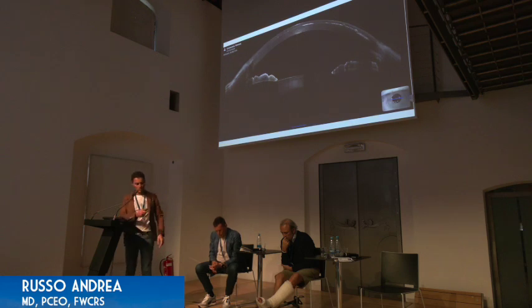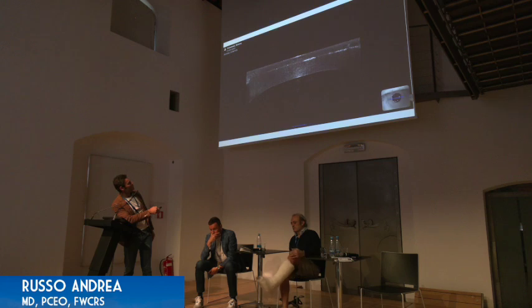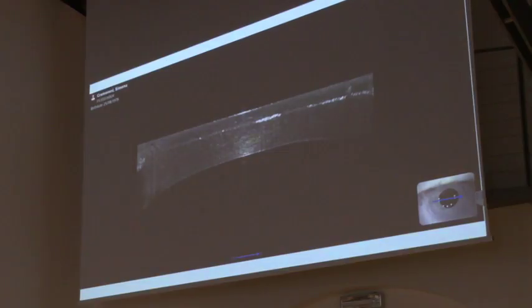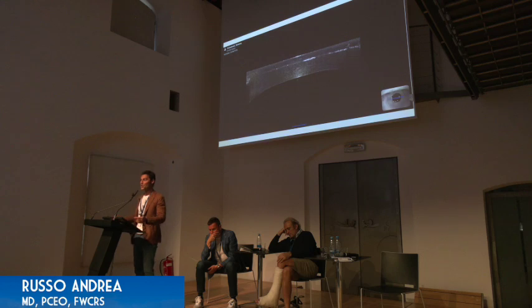But let me show you once again this anamorphic display, how useful it is. So before lifting the second flap, we wanted to be double sure that it was not intersecting the first one. And as you can see here, it was larger and deeper, not intersecting the first one. So this is the way to go ahead in these cases.